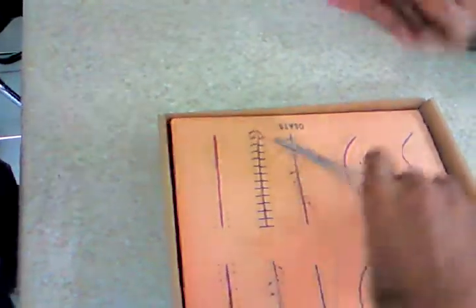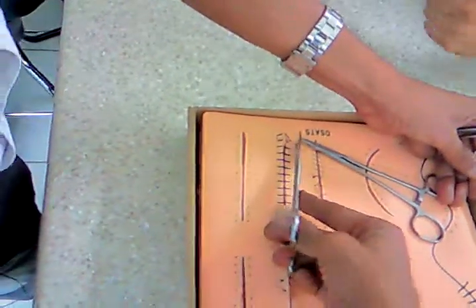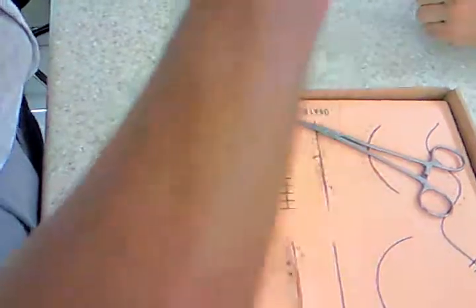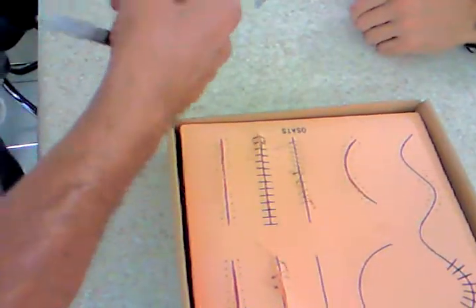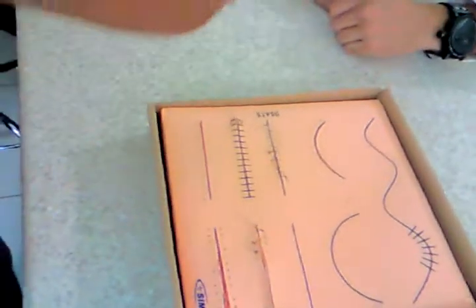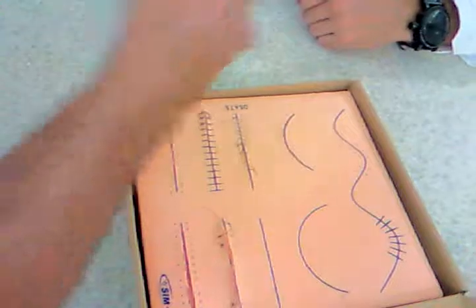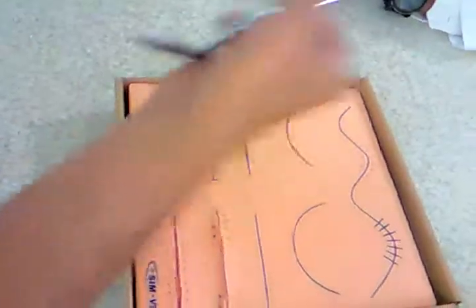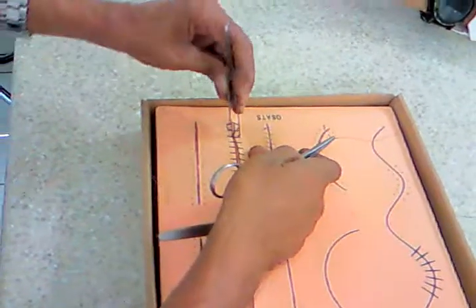I'll do one more. You wrapped around a scissor once for some of them. Is that okay? You wrapped it around the steel once for the last knot. Yeah, just for speed. Sometimes when you're alone, you don't have anybody assisting you, picking up the thread scissor again is very difficult. So you can hold it like this. This is a technique you can do. So you can just flip it, and you can cut again, hold it back. Flip, cut, hold it back. Because it's the last one, I thought I'll show you a few other techniques, which all of you will master anyway, sooner or later, if you are interested.